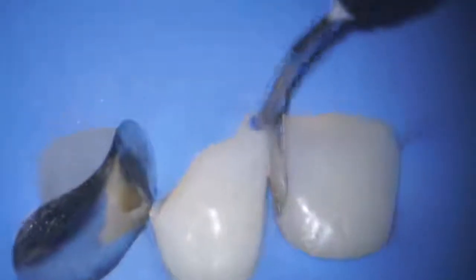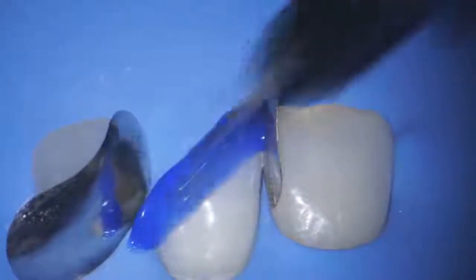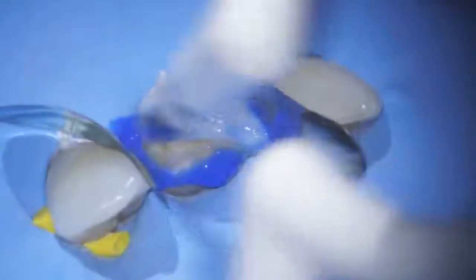So here you can see the stage of adhesive preparing. The application of acid gel is the first step. My favorite acid gel is the so-called Ultra Etch from Ultradent company. This particular acid gel has a specific chemical structure, much more preferable for our purposes, and the efficiency of etching with this kind of acid gel is much higher.